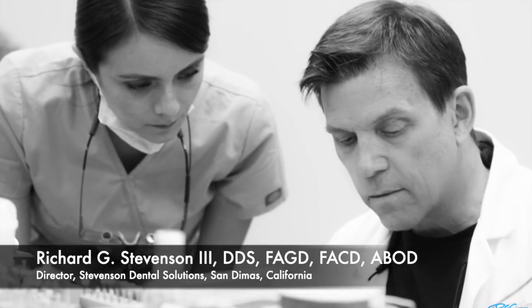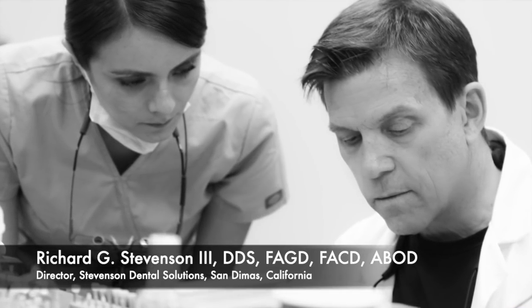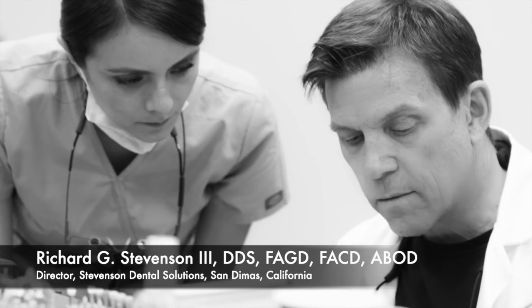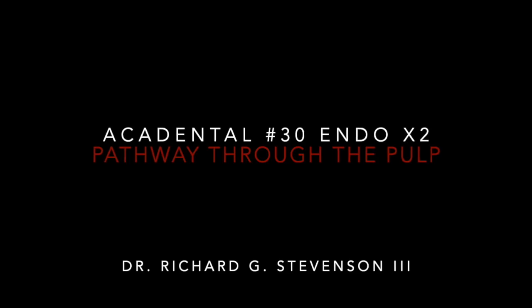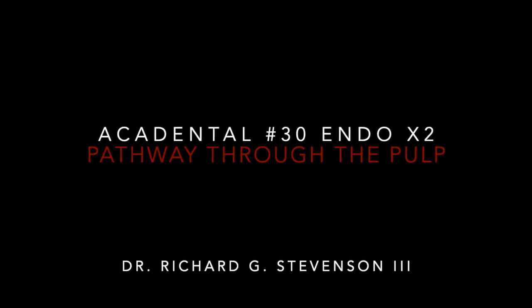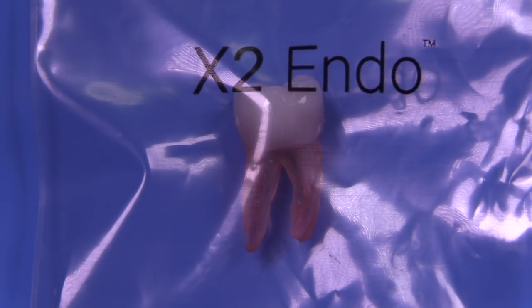Let's get right to it. We're going to be examining tooth number 30 from Aka Dental. This is their X2 endo tooth that is oftentimes assigned on various examination boards and licensing agencies throughout the United States.